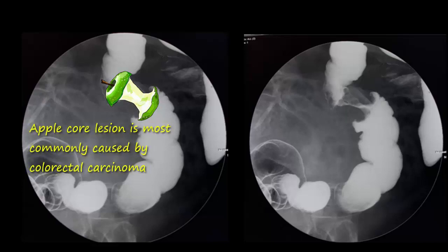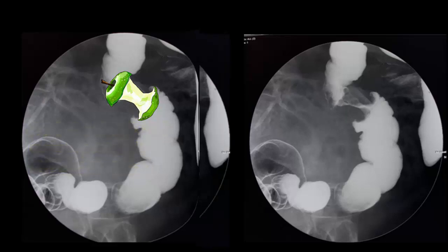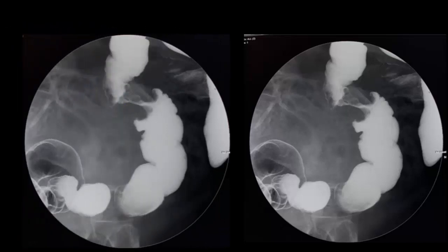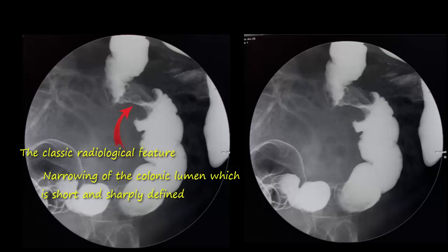The sign is typically and frequently seen in patients with colorectal carcinoma. However, it can be a serious mistake to assume that it always represents a colonic carcinoma. Histology remains the most reliable technique for the correct diagnosis. The classical radiographical feature of the colonic apple core lesion is narrowing of the colonic lumen, which appears as a short and sharply defined area on barium enema or CT scan studies.